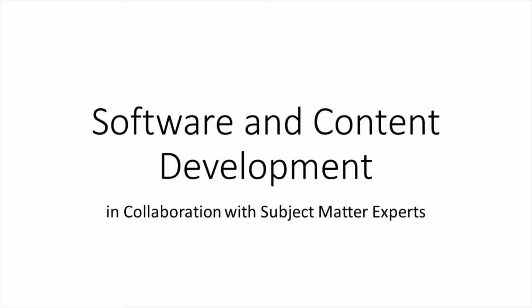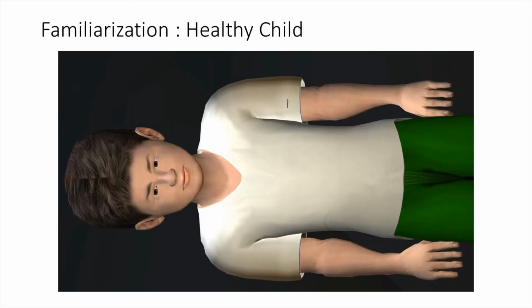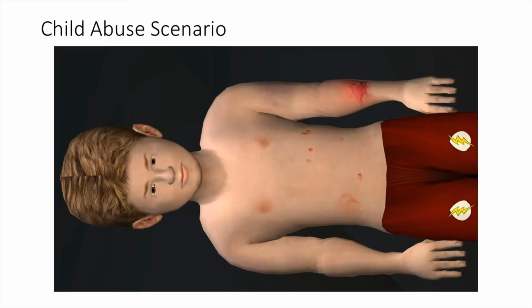In collaboration with subject matter experts from College of Nursing and College of Medicine, we identified medical scenarios to develop for the physical virtual patient bed. I created content for a healthy child, a child with early signs of sepsis, and a scenario with a child that shows signs of abuse for healthcare providers to recognize and report.